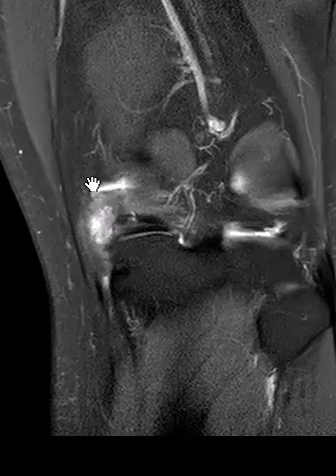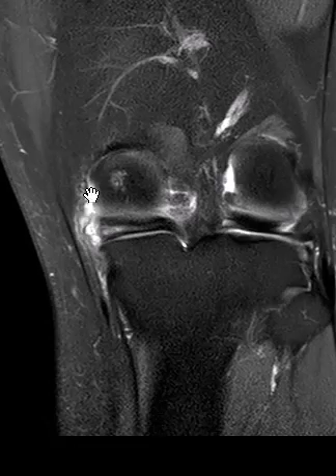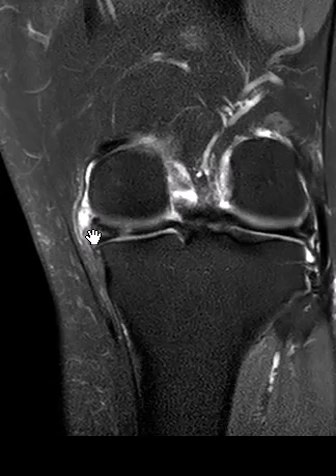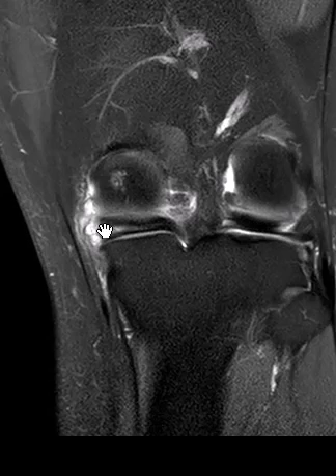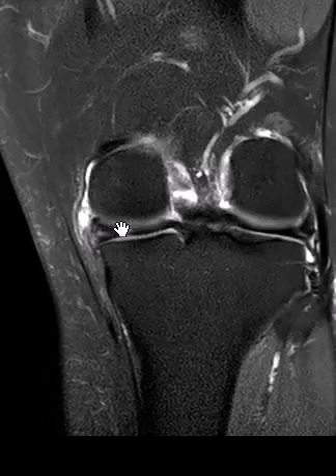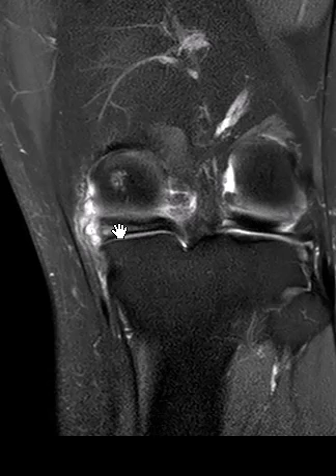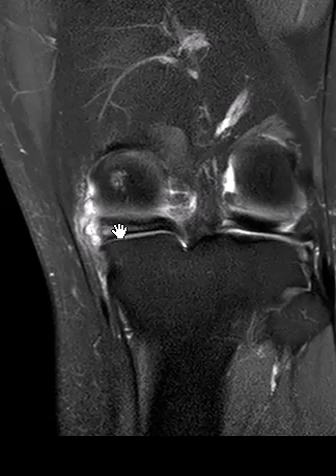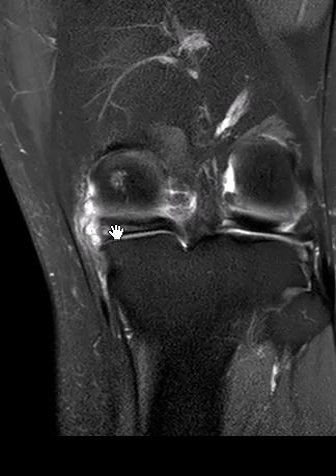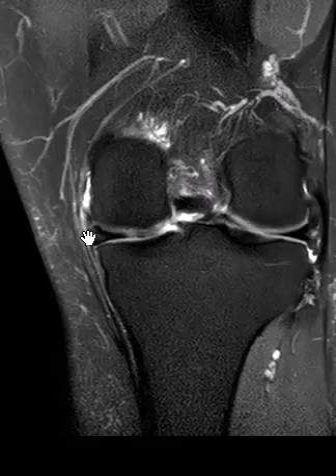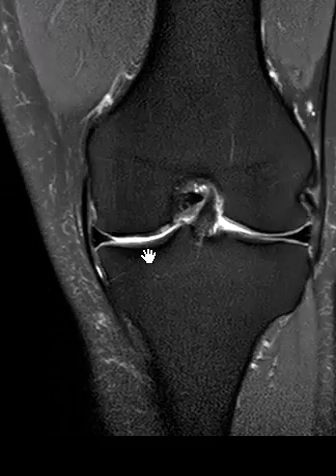As in this case, here's a pair of meniscal cysts along the posteromedial joint line. If it doesn't contact the capsular surface, this will expand the meniscus itself — the meniscus will be enlarged and bright with fluid signal, and we call that a meniscal cyst. Sometimes they're together: you have a meniscal cyst and then a parameniscal cyst.